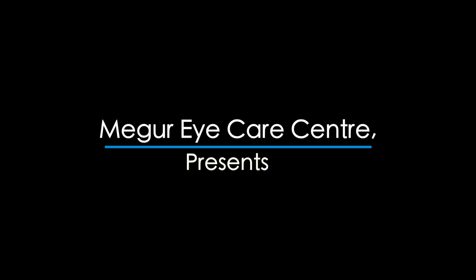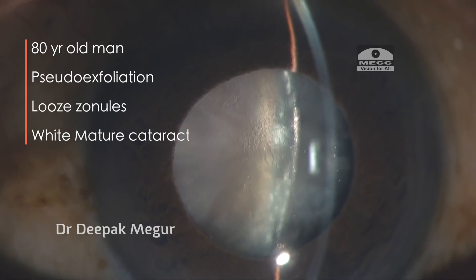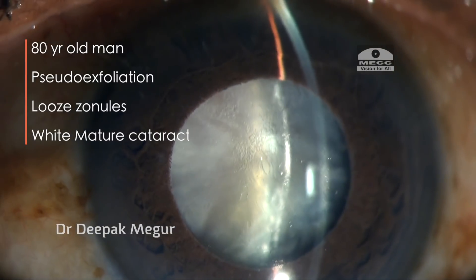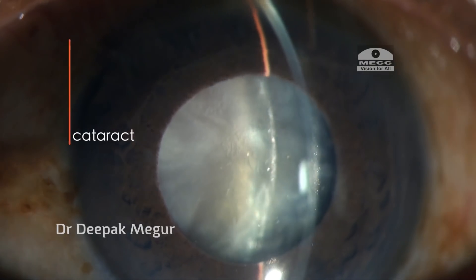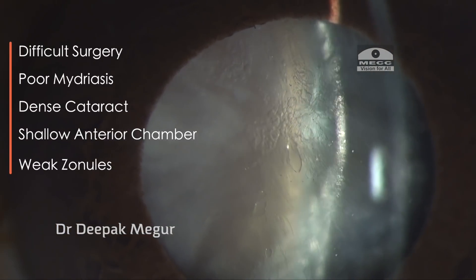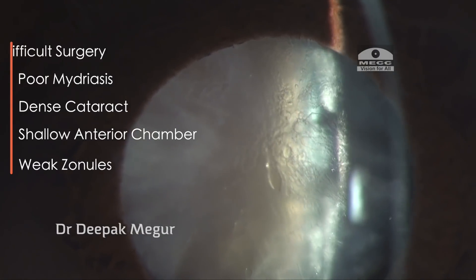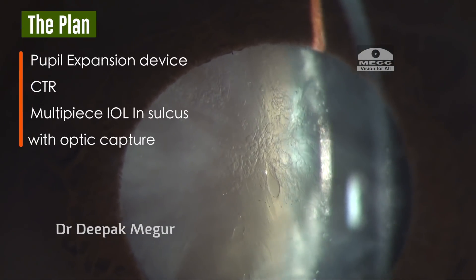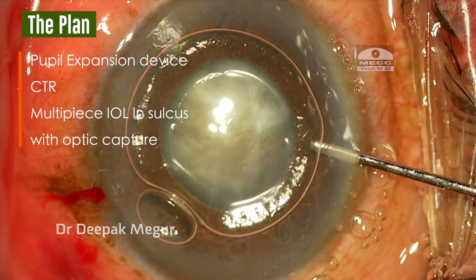Today's case is about an 80-year-old man with pseudoexfoliation, loose zonules, and a white mature cataract. Because of these multiple complexities, I'm expecting a difficult surgery. Poor mydriasis, dense cataract, and a shallow anterior chamber with weak zonules all have to be dealt with. The plan is to use a pupil expansion device, a CTR to stabilize the bag, and a multi-piece IOL in the sulcus with optic capture.